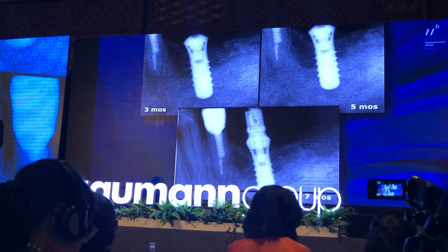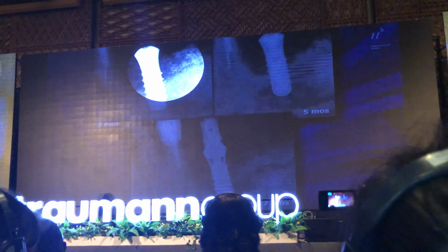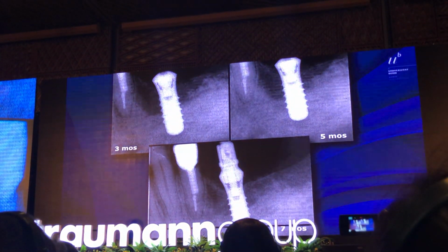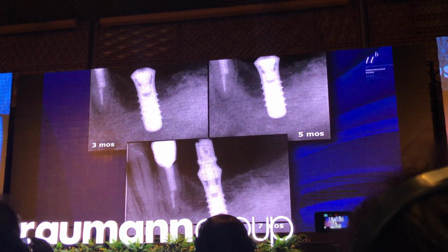Okay, and you see what we got. At that time, this is 3 months here. 3 months, still submerged. I told the lady, I do not see too much of new bone formation. We got to wait. It will take longer, big defect. So patient came in at 5 months, still submerged. And you're going to see a little improvement, but still not perfect.